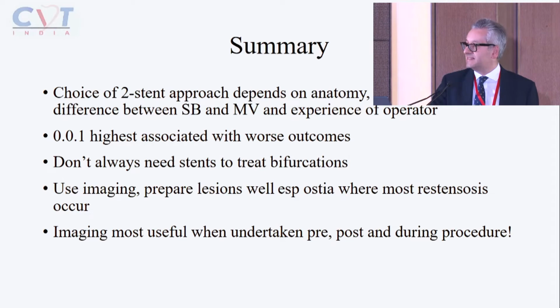001 is associated with the worst outcomes. It's not a benign lesion, much worse than 111 lesions. So if at all possible, avoid stenting these lesions. If you do need to fix it, then I think cutting balloon and drug-eluting balloons are very reasonable.